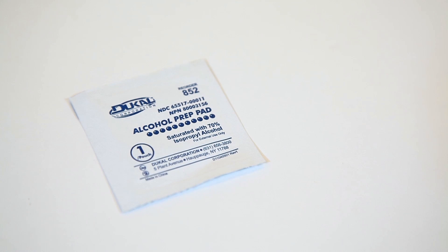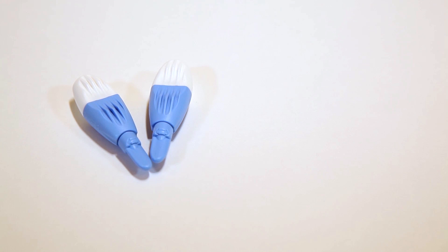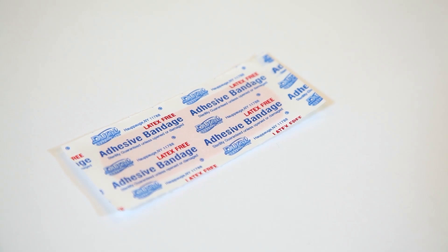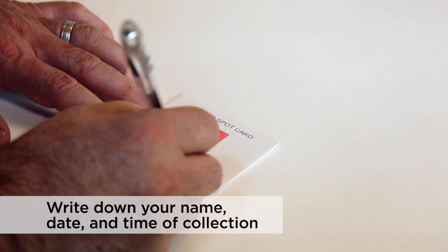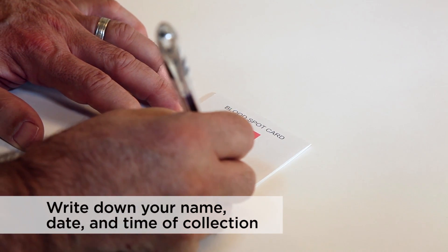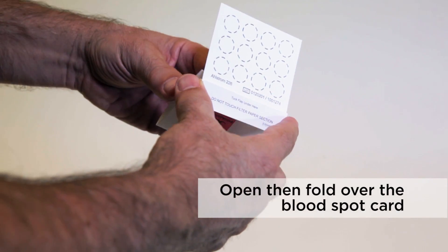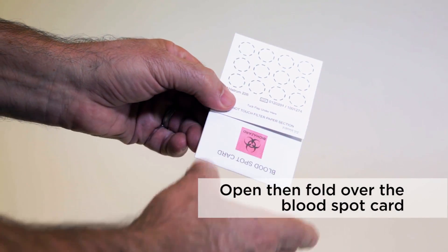You will need the alcohol and sterile gauze pads, the lancet used for drawing blood, the blood spot card, and the bandage. Print your name and collection date on the blood spot card with an ink pen. Next, open the cover of the blood spot card and fold it away from the collection filter paper.